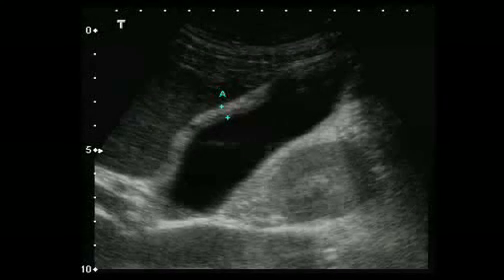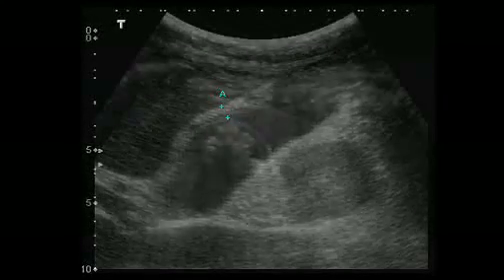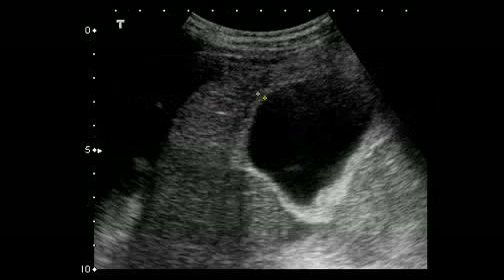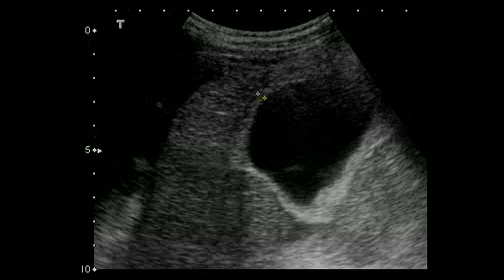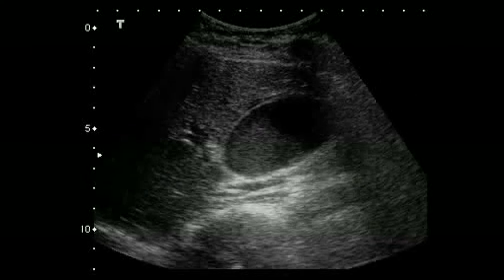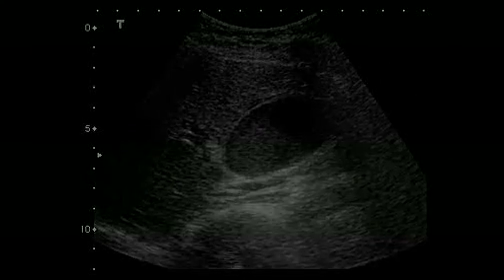The findings in cholecystitis include thickened anterior wall greater than 4 millimeters, pericholecystic fluid, and/or a transverse diameter greater than 5 centimeters. Some bacteria will cause an emphysematous wall, necessitating immediate surgical intervention. Pushing on the probe while the gallbladder is centered in view may elicit an exacerbation of the patient's pain. This is known as a sonographic Murphy's sign. Finding sludge in the gallbladder is common, although nonspecific.